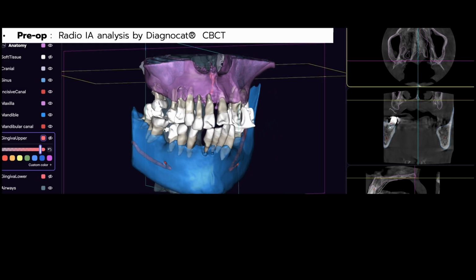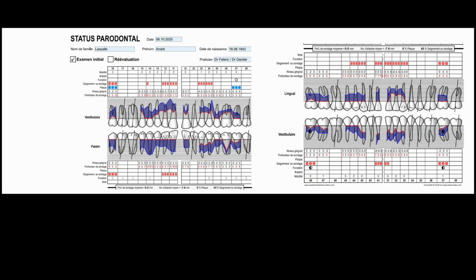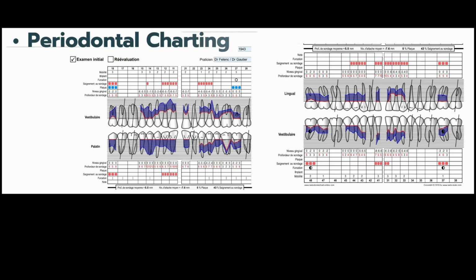And we have to do a final, as you said, Sébastien, a definitive final way, a specific treatment. But thinking also about the problem of brushing the teeth of the patient, because he's 82 now. Probably he is able now to brush his teeth in a perfect way. But what would be the future in 10 or 12, or 15 years? How will he be able to clean the teeth? And the gums too, we saw there was a big periodontal disease problem here, an issue, and we want to treat it first, of course, but we want to think about the future in 10 or 12 years.